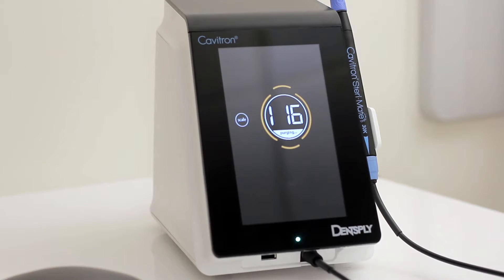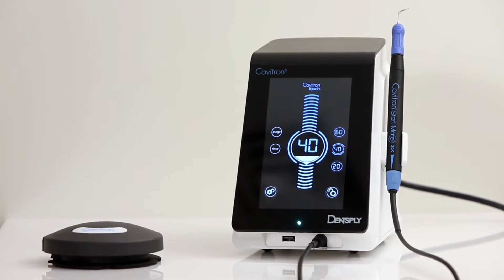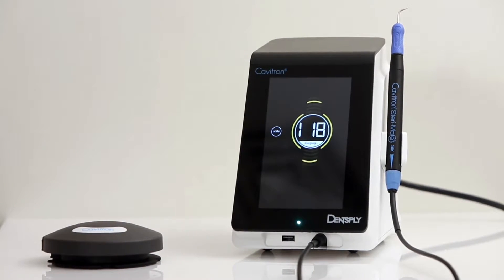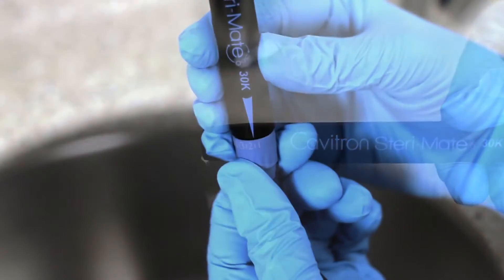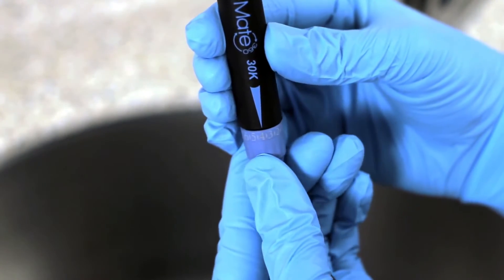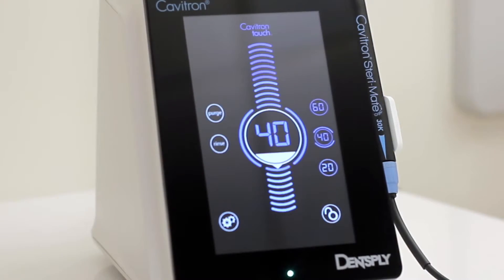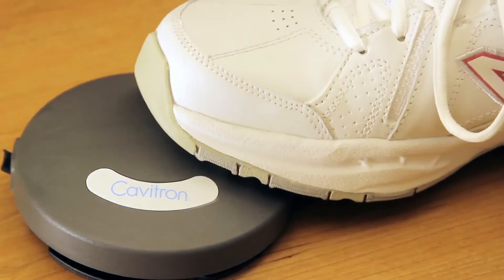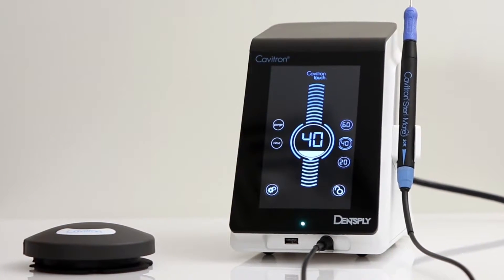Use of purge feature: This setting is used to flush the water lines at the beginning of the day or between patients. Purge will run automatically for 2 minutes and adjustments can be made for maximum water flow with a countdown in seconds shown on the screen. Push the scale button to return to the main screen or simply tap the foot pedal. After a 2-minute countdown, it will then return to the main screen.